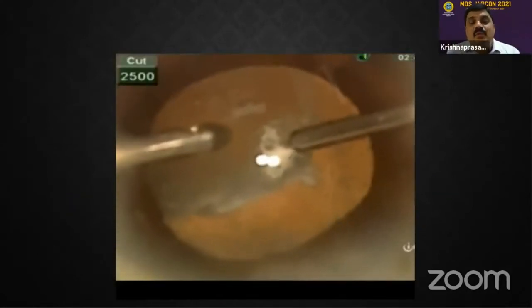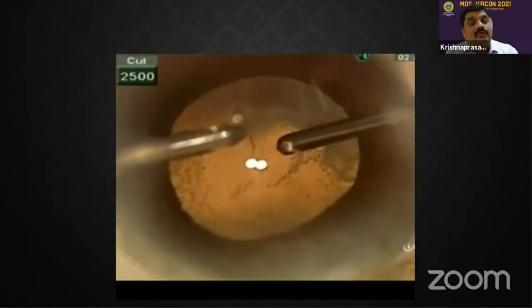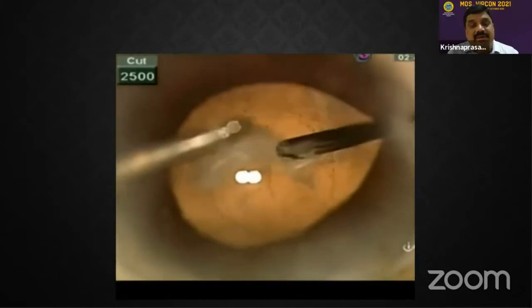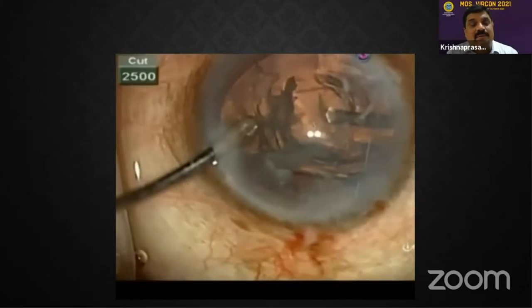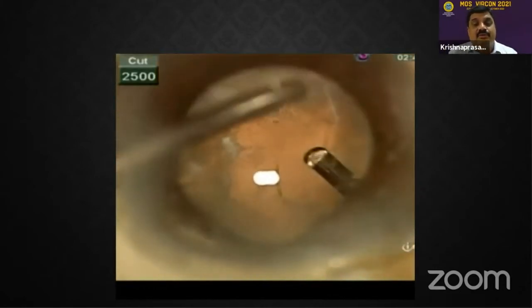Now most of our friends, those who are good retina surgeons, are also good phaco surgeons. Like this has been described by our friend, Dr. Abhay Aswada, he goes through the pars plana. He makes a pars plana entry, takes the vitrectomy cutter to the pars plana.